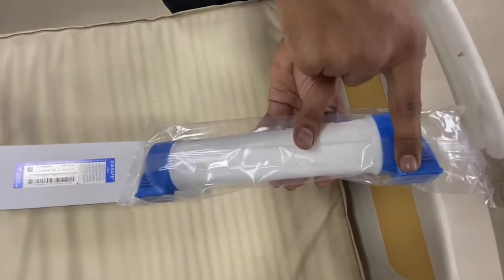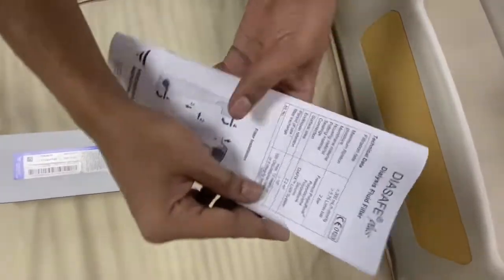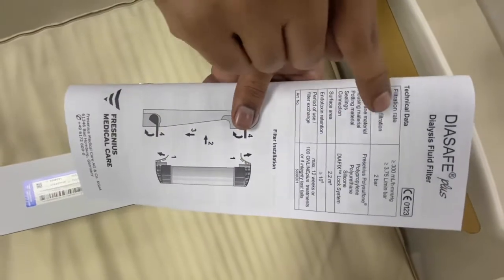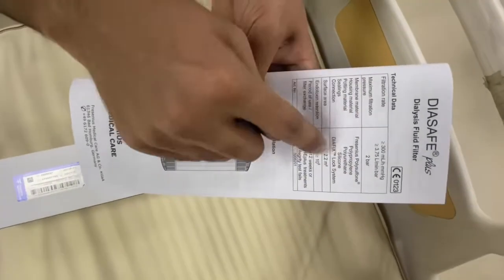It has only two ports: one for inlet and one for outlet. If we look at the details, the membrane is made up of polysulfone and the outer part is made up of polypropylene.